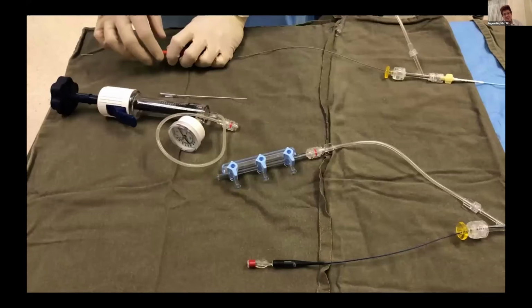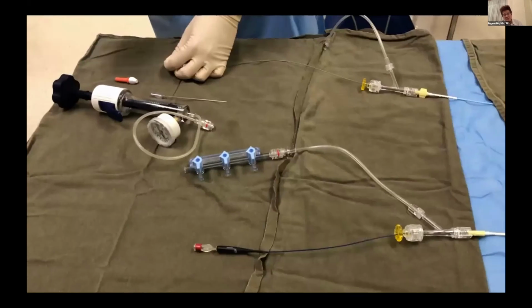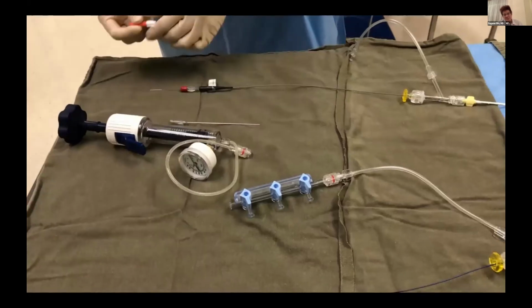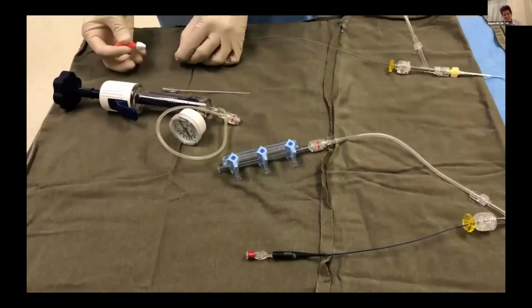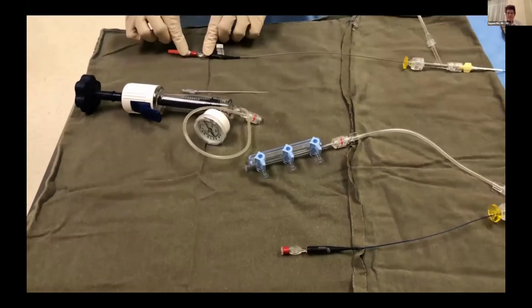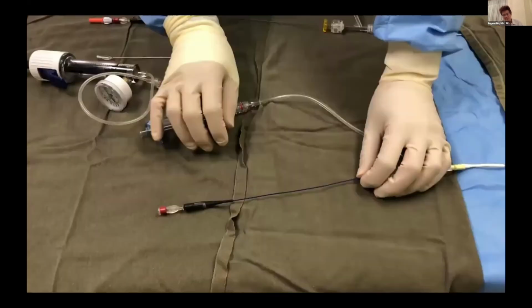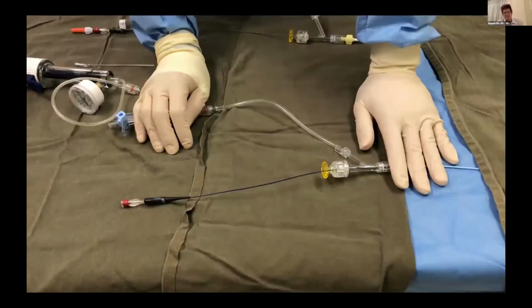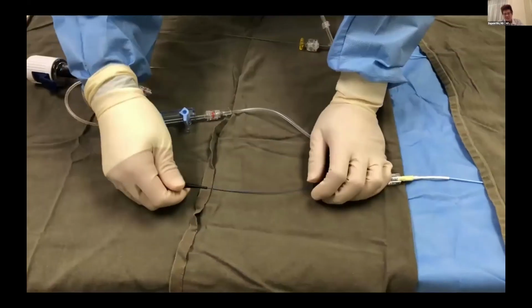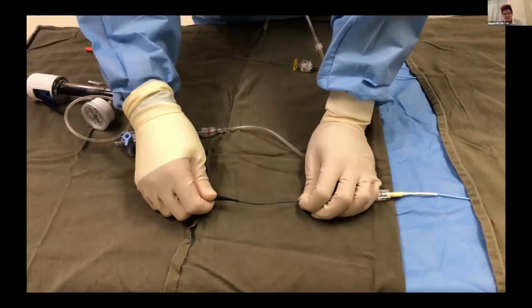When we successfully get tip-in, what we must do is to gain the most amount of force for antegrade delivery. So we should push the retrograde wire as far as possible, leaving only 5 centimeters or so outside. And we should secure it by placing a torque device onto this wire and making sure that we torque it tight against the hub of the retrograde microcatheter. Then we can make sure we have adequate backup for the antegrade side. If we need to, use a guide extension catheter or side branch anchor balloon. And we can then try to turn the antegrade Turnpike Gold to follow the path of the retrograde wire to go through the lesion.